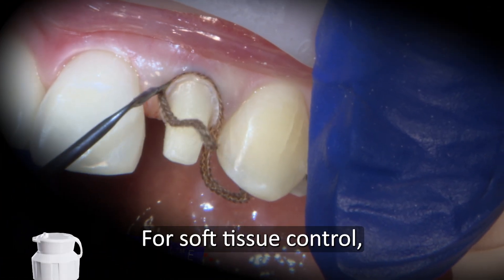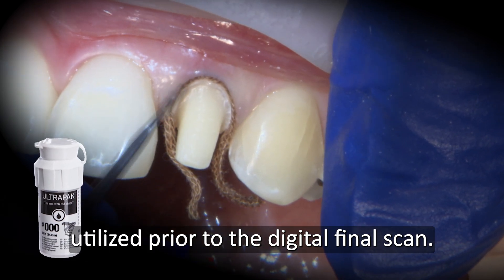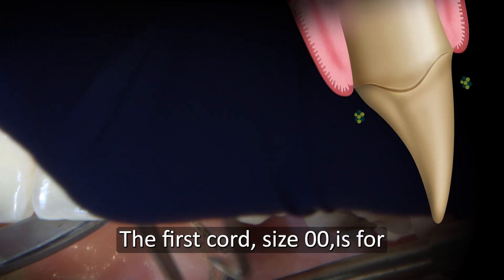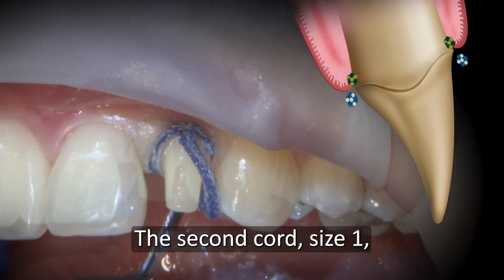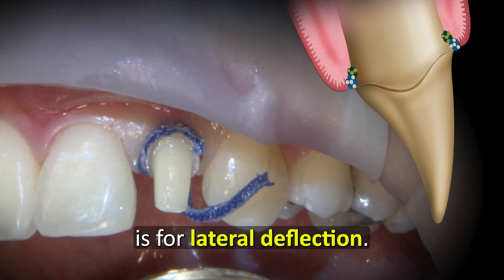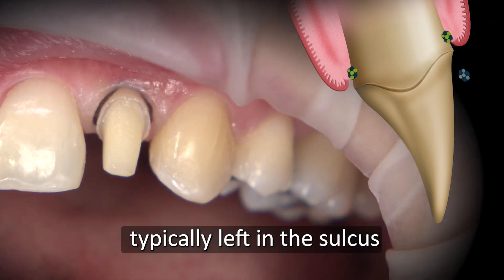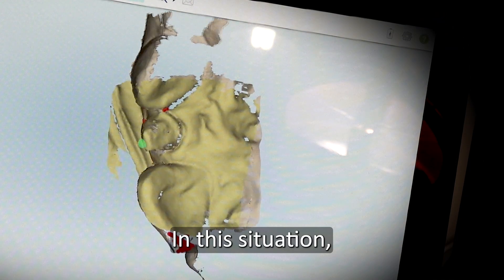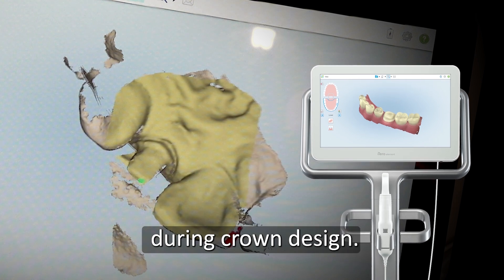For soft tissue control, a two-cord retraction technique is utilized prior to the digital final scan. Using Ultradent's Ultrapack cord, the first cord, size 00, is for apical compression without hemodent. The second cord, size 1, previously soaked with hemodent, is for lateral deflection. After 5 minutes of compression, the first cord is typically left in the sulcus and the second cord is removed prior to scanning. In this situation, both cords were removed to get a more natural emergence profile during crown design.